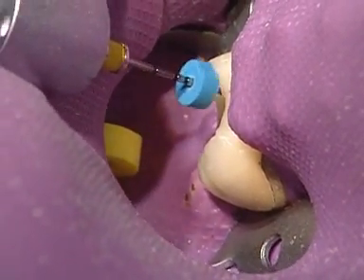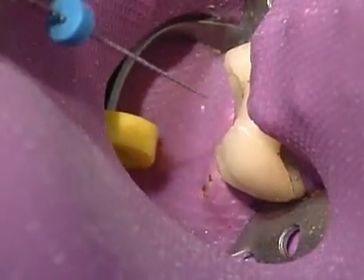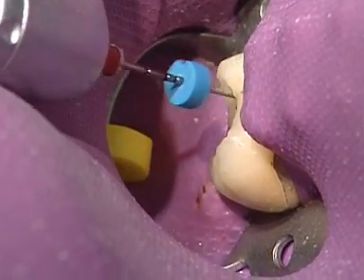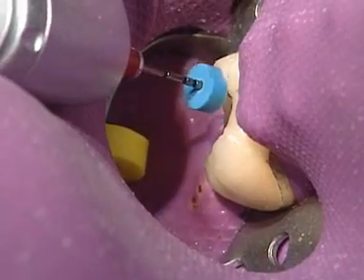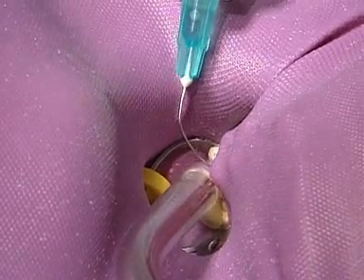Apical enlargement is then carried out with taper 2 instruments in increasing sizes until the required ISO size is reached. The canal is then thoroughly rinsed again.